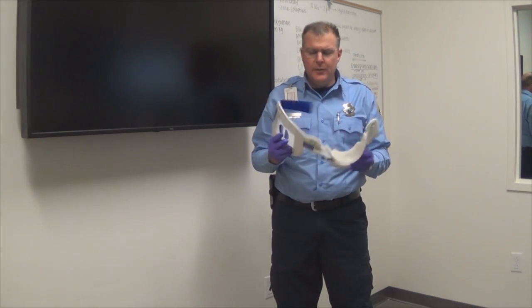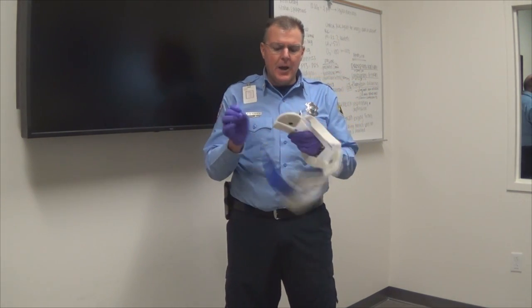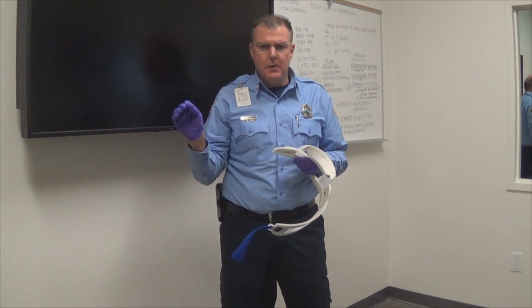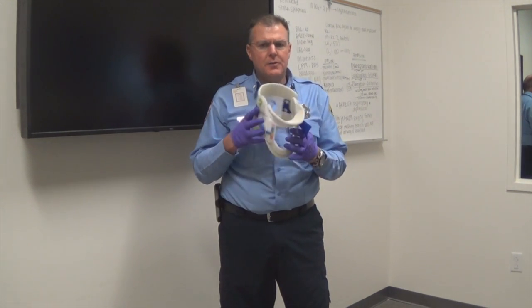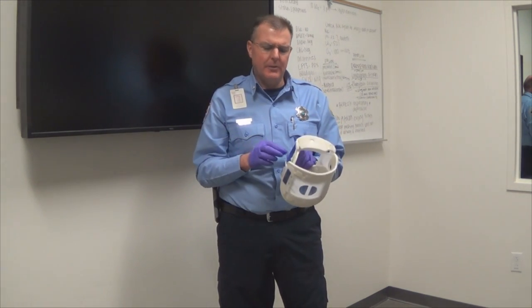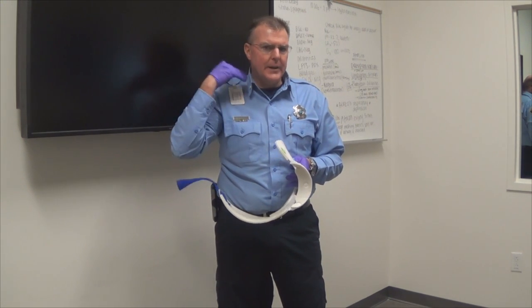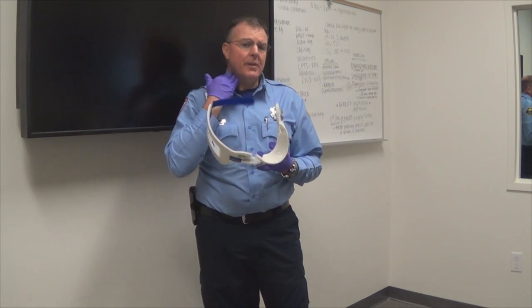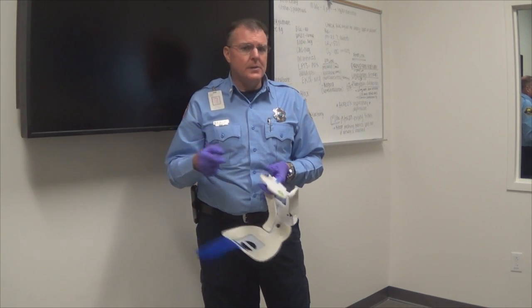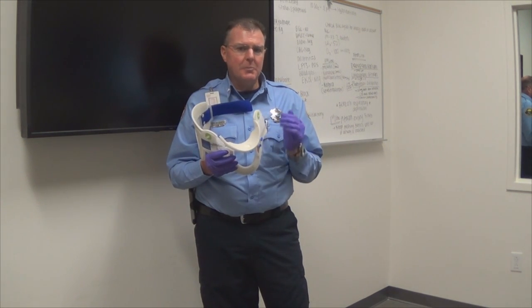Just a quick point on these C-collars: when you place these on patients, make sure that you're not putting them on too tight. There's been a lot of times I've arrived on scene — and it's not just the fire department, it's EMS as well — where people are putting these collars on too tight around the patient's neck. Think about what that's doing. That's like putting a tourniquet around their neck. They're going to get some arterial flow up in there, but the venous flow, because it's lower pressure, is not going to come back out because you've restricted it. If they have a head injury and ICP is increasing, it's going to increase it more. So make sure when you're putting these collars on and securing them to the patient that you're not putting them on too tight.